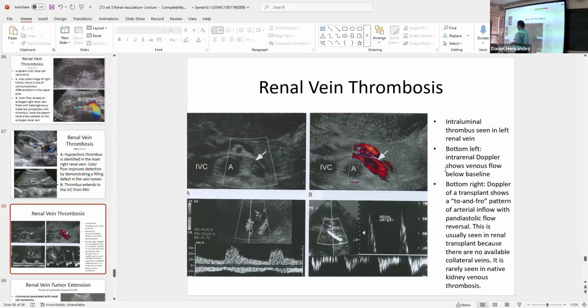That was a nice picture, again. Patient looks like they're suffering from nutcracker syndrome, so we're transverse now. Got aorta, SMA, that left renal vein being sandwiched between the two. So it's very, very thin through there. Then we get the dilatation. So again, there's probably stasis of blood that happened right there because of that nutcracker syndrome. Clot developed. There's still some blood flow getting around it, so it's partially occlusive. With color, we can see the blood flow getting around that central thrombus, getting through that little stenotic area, trying to make its way into the IVC.